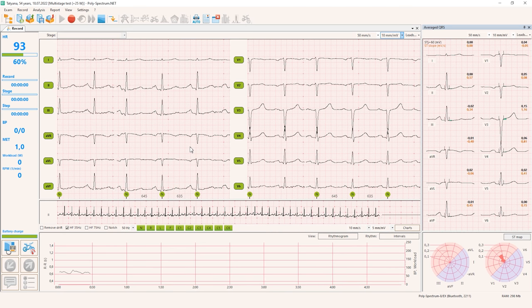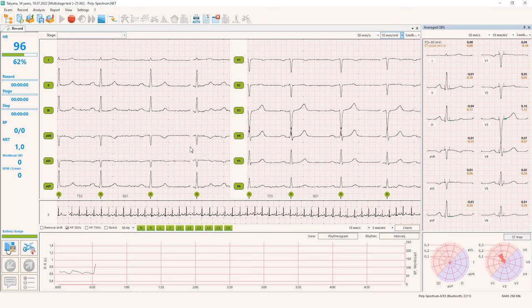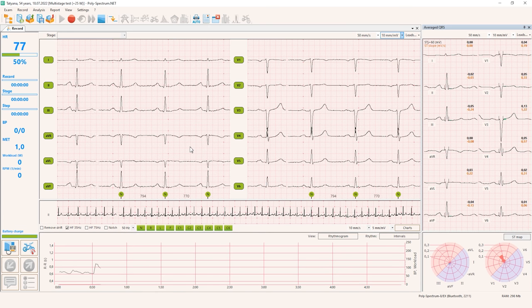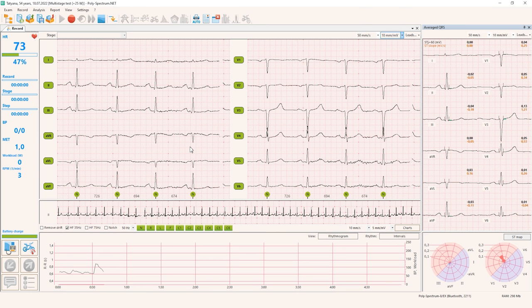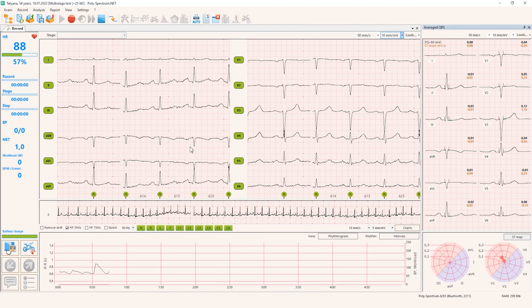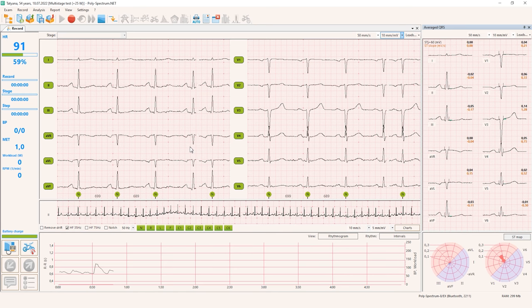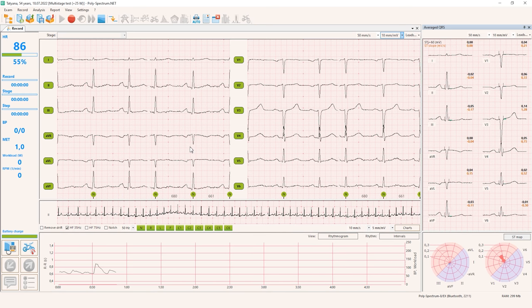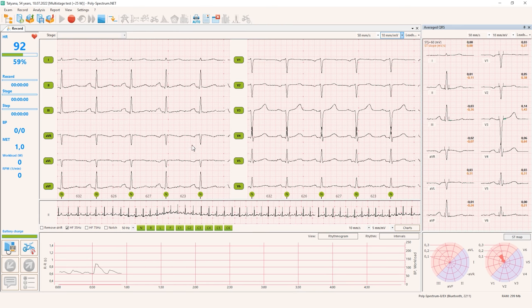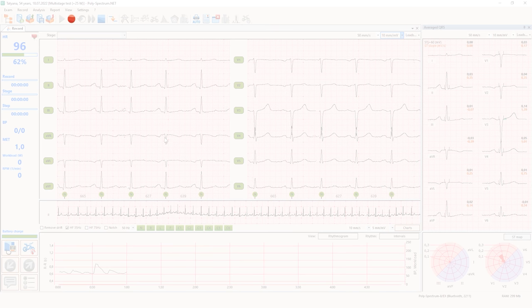For example, I can see some arrhythmias, I can see conduction blocks, or some signs of ECG that cannot be analyzed for ischemia, like Wolff-Parkinson-White, for example. Yes, that's not a contraindication for the test itself, but it's the reason not to perform the test for ischemia diagnosis, because I can see nothing with this kind of ECG. But now our ECG is okay.